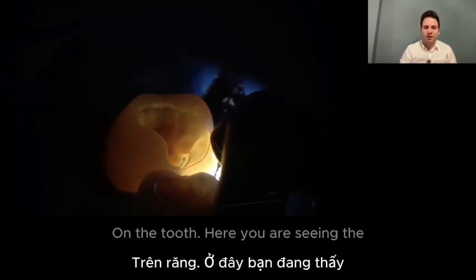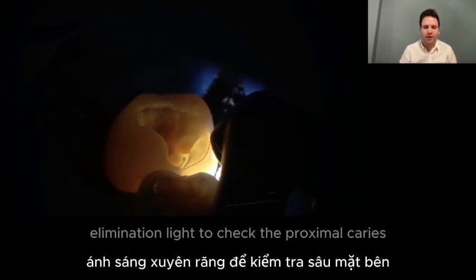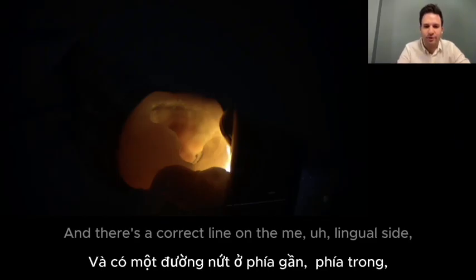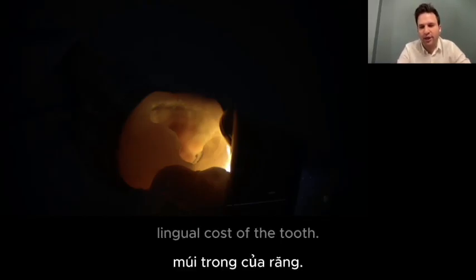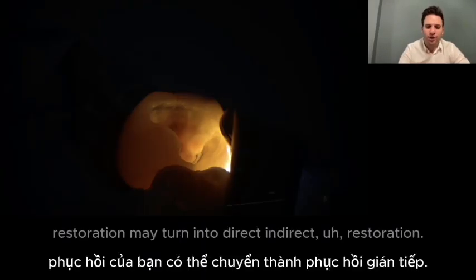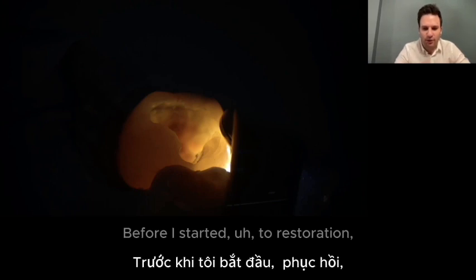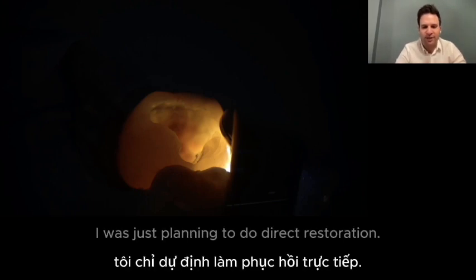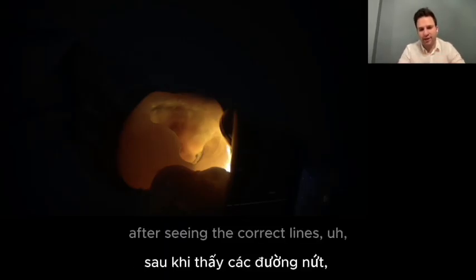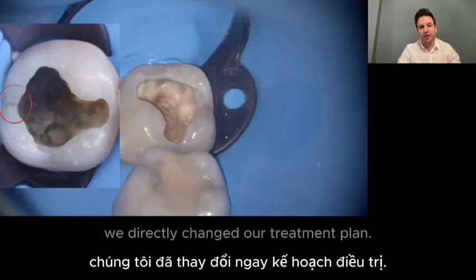Here you are seeing the illumination light to check proximal caries or also crack lines on the occlusal surface. And there's a crack line on the mesiolingual cusp of the tooth. So that means your restoration may turn from a direct restoration into an indirect restoration. Before I started the restoration, I was just planning to do a direct restoration, but after seeing the crack lines, we directly changed our treatment plan.